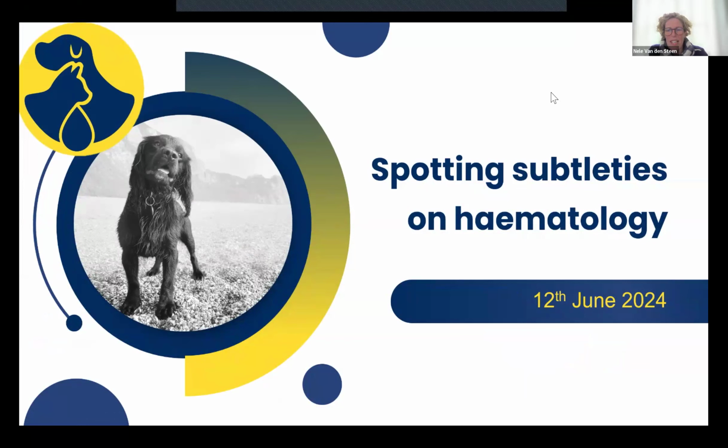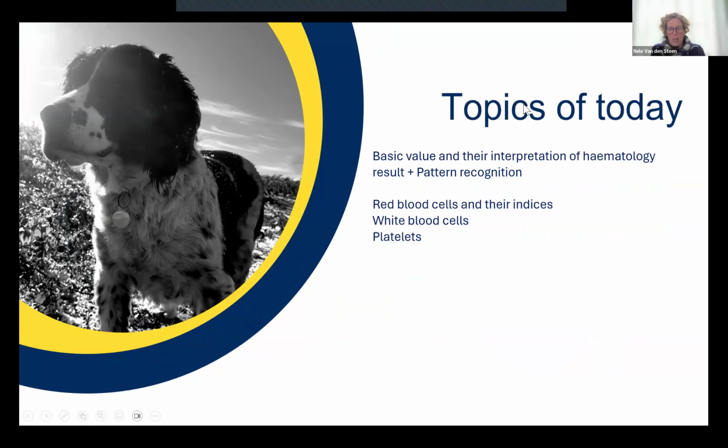So hematology is one, obviously, of the blood tests that we very commonly do in practice on a daily basis. It gives us an overview of the red blood cells, their indices, which we're going to talk through a little bit. We're going to talk a little bit about patterns with the white blood cells and what we should consider when they go high or low. And we'll talk a little tiny bit at the end about the platelets. Obviously, take into account, this is a quick overview. This is not the end all and be all of hematology, which is incredibly interesting.